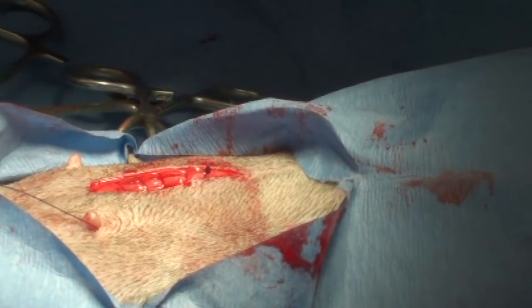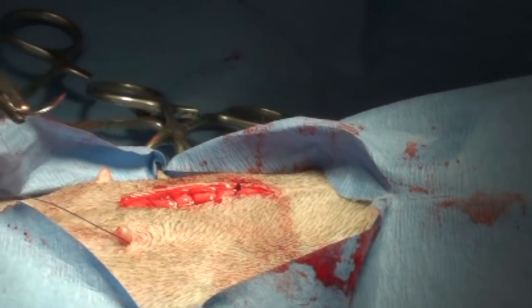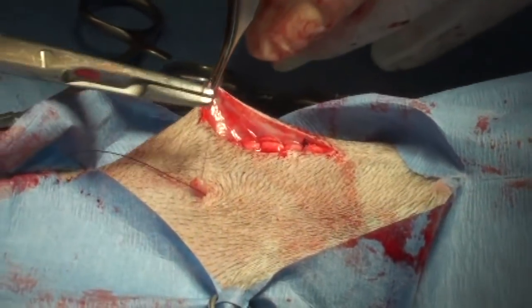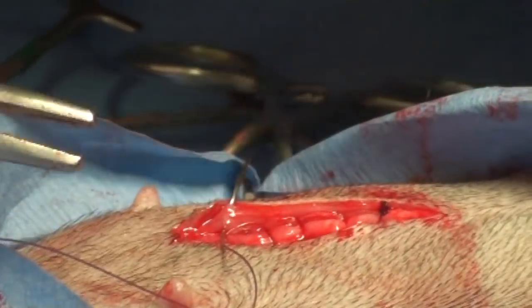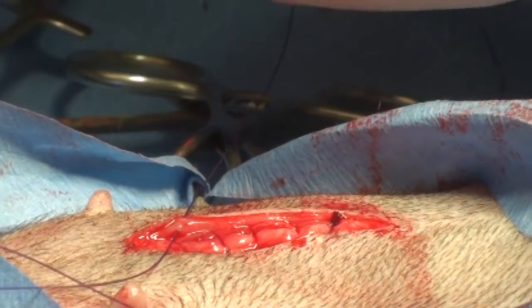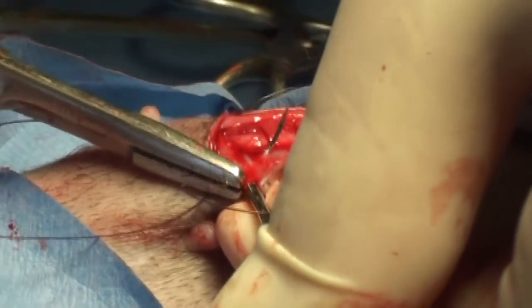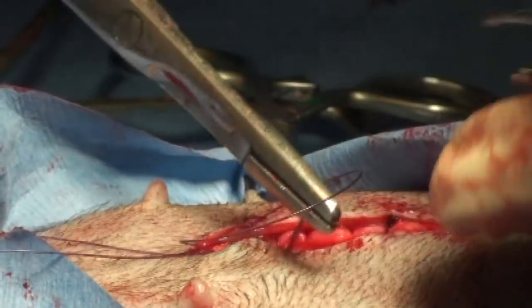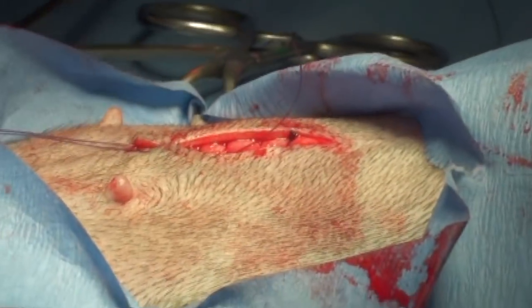Now we're going to use the most important stitch veterinarians put in — it's under the skin, the sub-Q stitch. We grab the needle, grab the side of the skin, put it up against the skin and it comes out. On the other side we go the opposite direction, it goes down. And then it pulls the skin together — see how it does that?